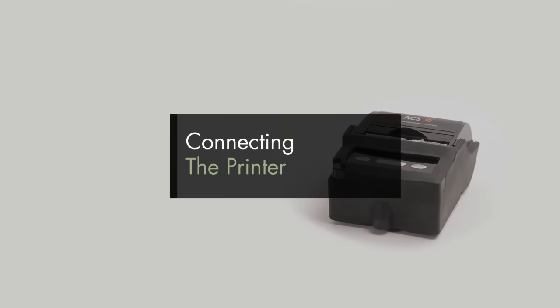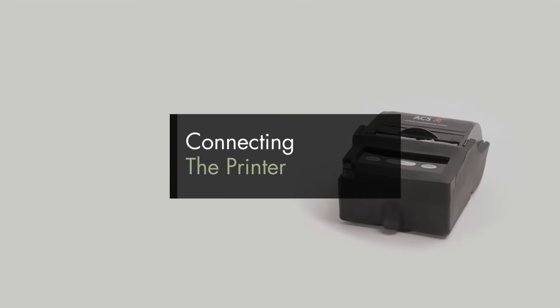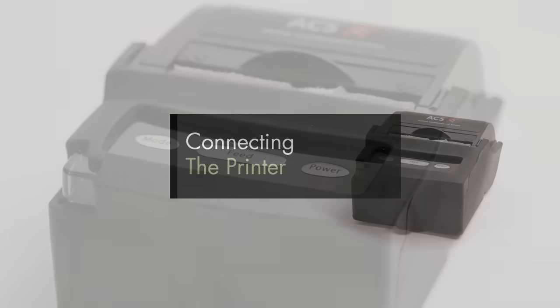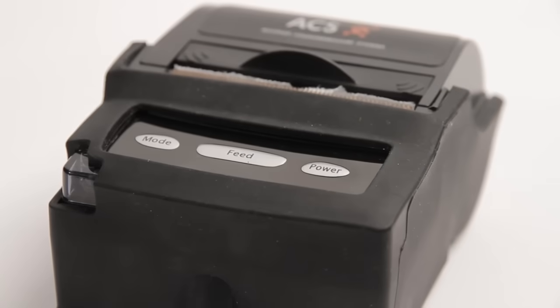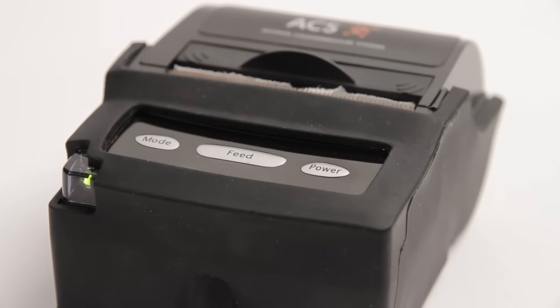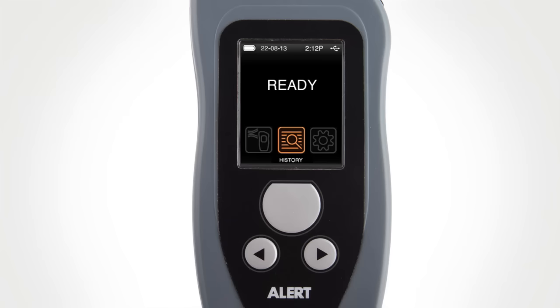Setting up and pairing the printer. The Bluetooth printer provided is already paired at the factory with the Alert J5. Follow this procedure for pairing the printer if it is replaced in the field. Press and hold the power button until the battery light illuminates and the printer turns on.